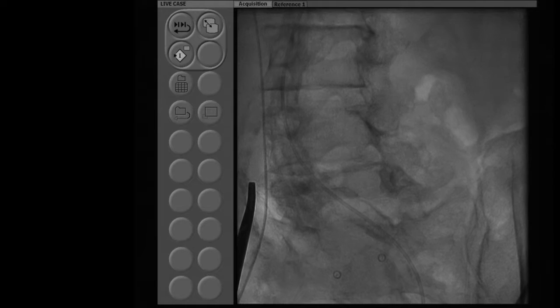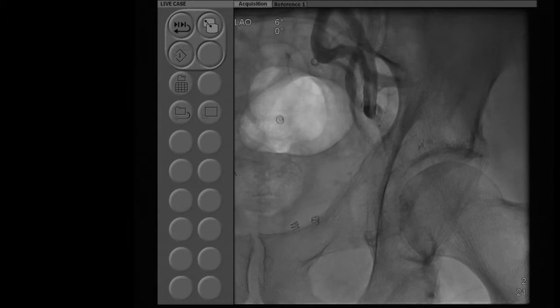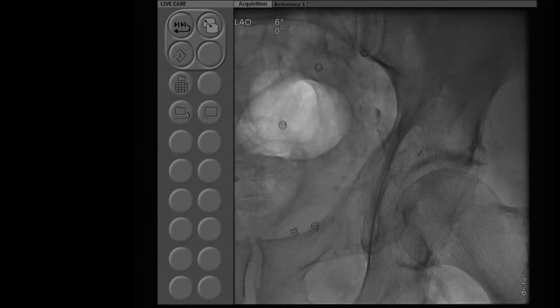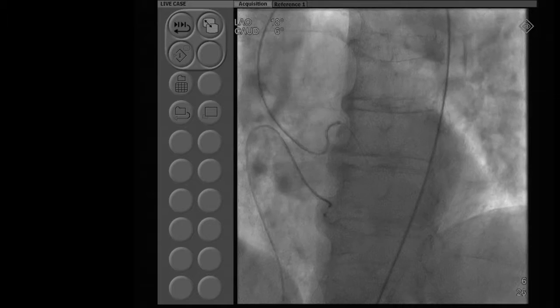We have one pre-close only. This case has multiple PTAs — look at the calcification and the hole. Not uncommon for these cases to have had multiple femoral and popliteal PTAs in the past. But there is a clear skeleton of the vascular vessel, which is okay. This is not uncommon for these patients. We have crossed the valve into the LV and the gradient is about 50, exactly as we felt.